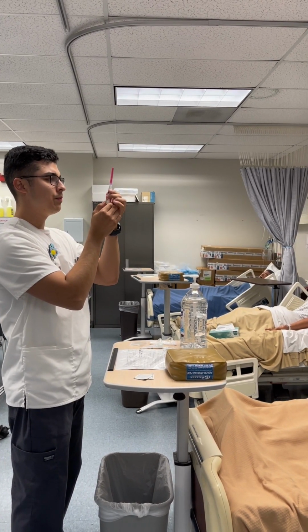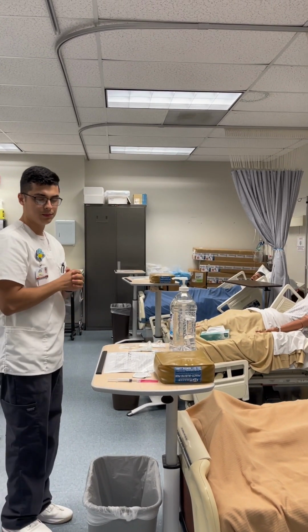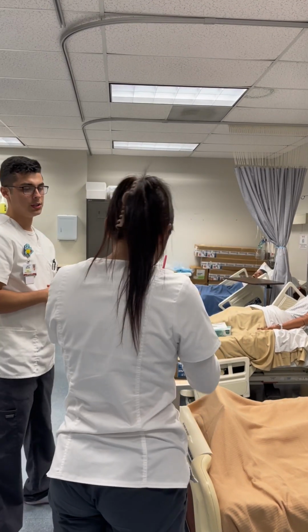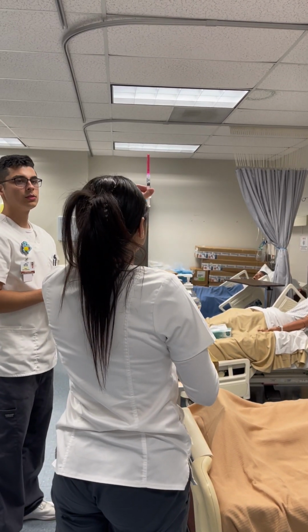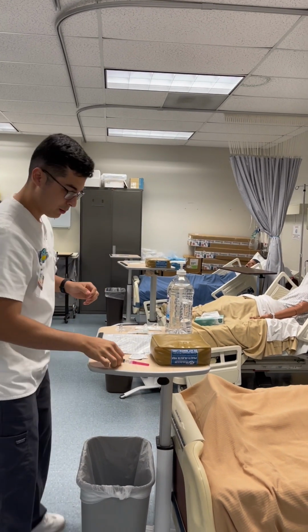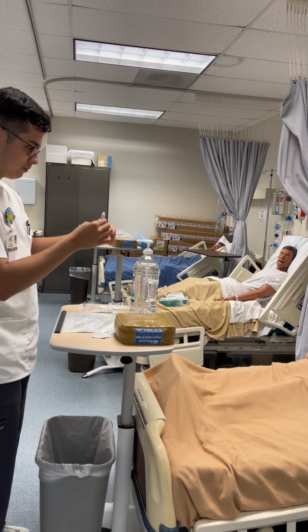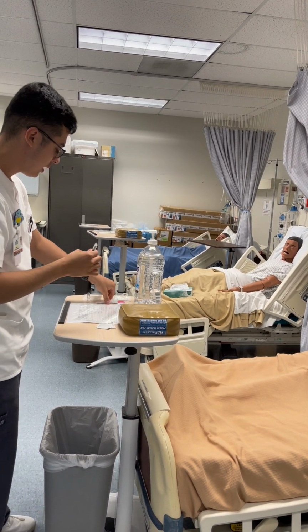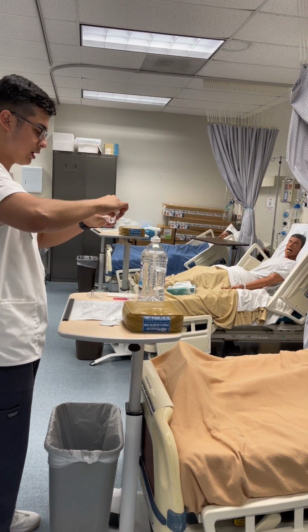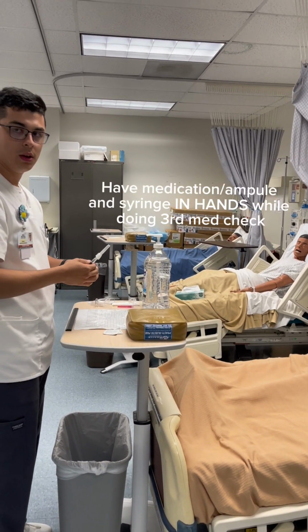Okay. I'm going to ask the professor to make sure it's good. So I'm drawing 1 ml for this patient. Alrighty, in that case, get rid of the filter needle. Set it down to the side. I'm going to use my 21 gauge needle, connect that. Okay, so now that I have my medication, I'm going to do my third med check.